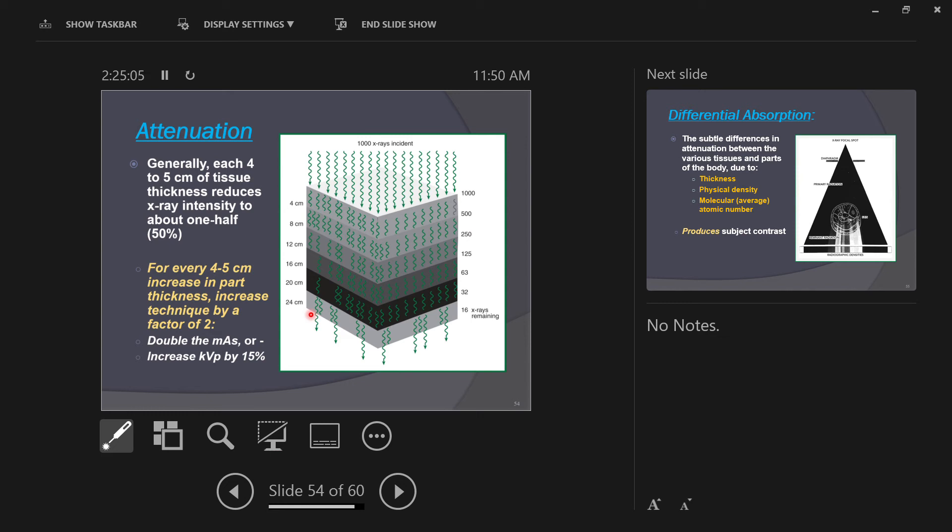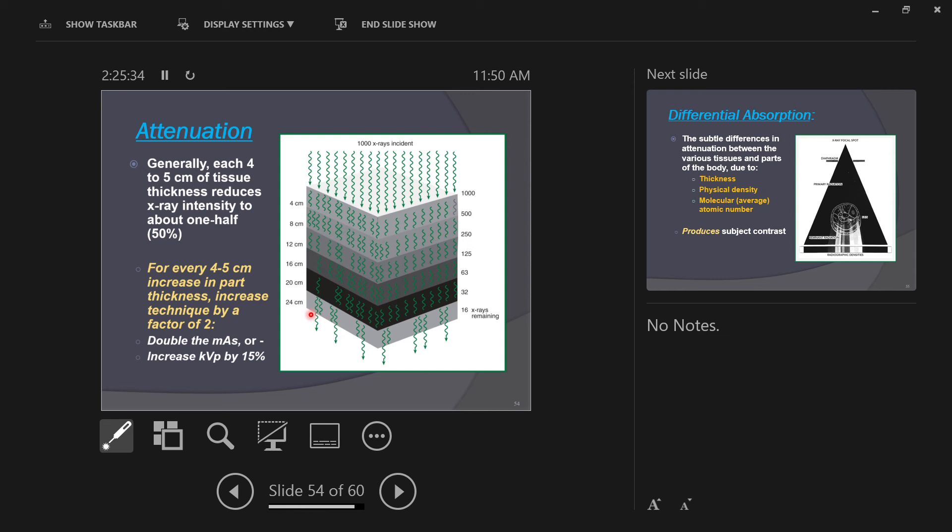So, again, I have a choice when I'm going from AP to PA or AP to lateral. On Enrique's hand, I can go to 69 at 3 or 60 at 6. And if I decide to go to 60 at 6, I could keep the exposure time the same as it was on the PA. So, I don't have to change exposure time. So, it's not to help with exposure time, although we could have chosen a setting that gave us a longer exposure time.